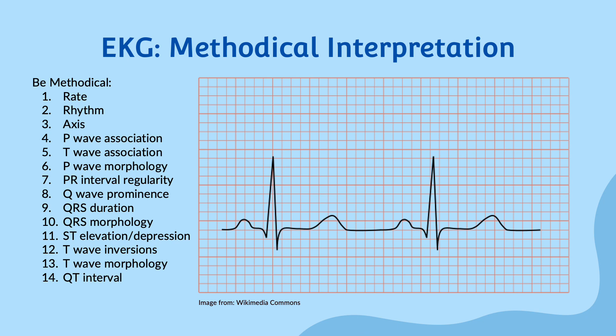We can also make sure that there are no T wave inversions, which may be indicative of other pathologies. Finally, we can check the QT interval to ensure that it is within normal limits, which typically ranges from 0.35 to 0.46 seconds. This is important as a long QT interval may predispose patients to deadly arrhythmias such as torsades de pointes.